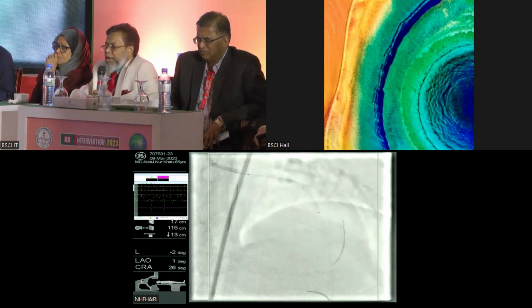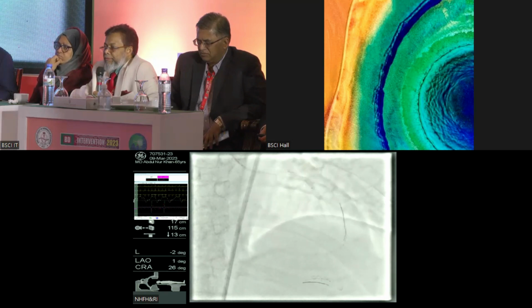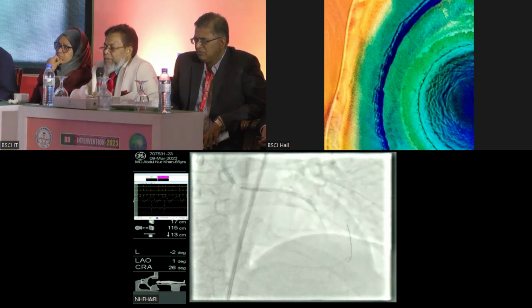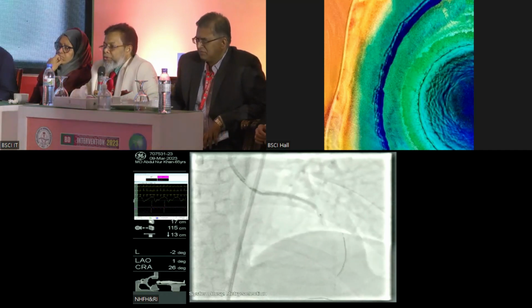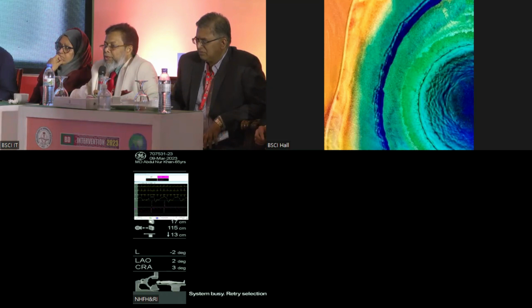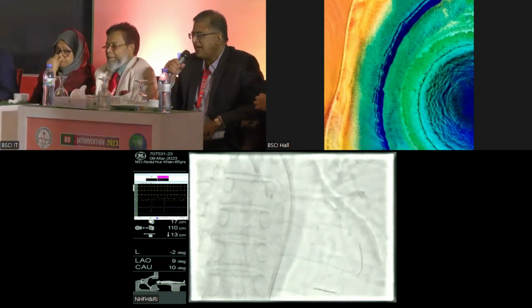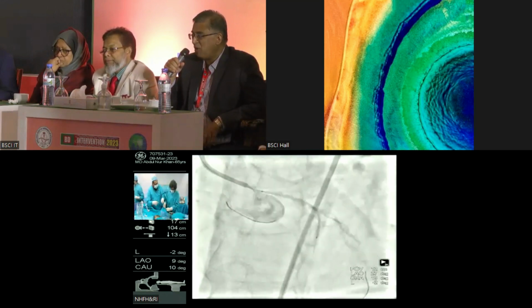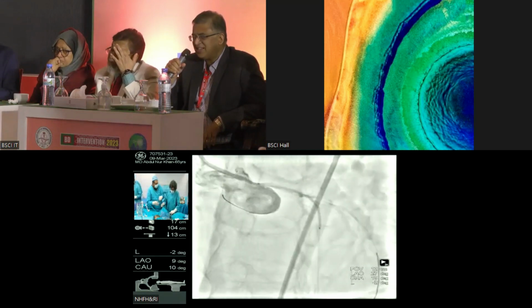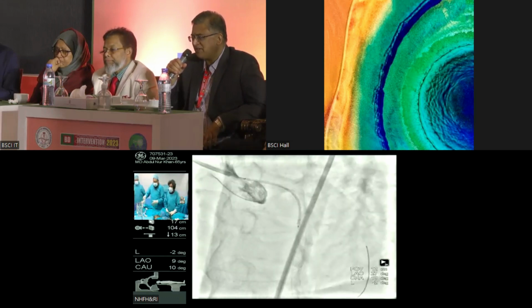So we are removing our floating wire, and we're pulling back our stent balloon. And we are going up. And for our younger colleagues, to inflate the ostial stent, usually we keep in the LAO cranial view for the newer ones. But for an expert, you can do anything in any view. The extra wire in the root actually helps provide the ostium pinpoint, where you can put the proximal end of the stent. That really helps. Otherwise, LAO cranial would be better.